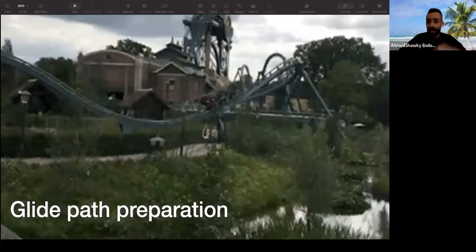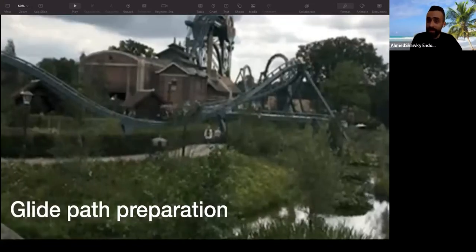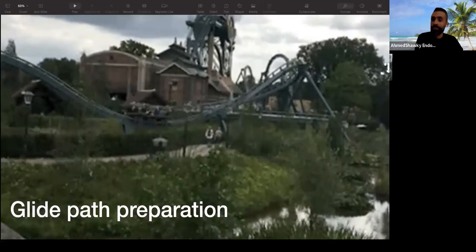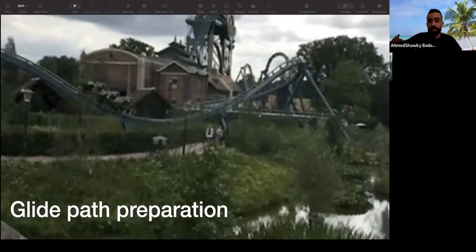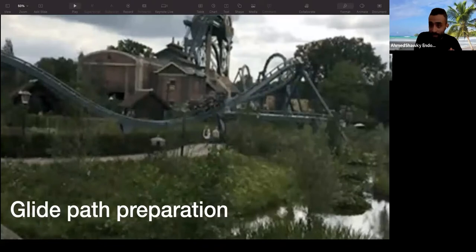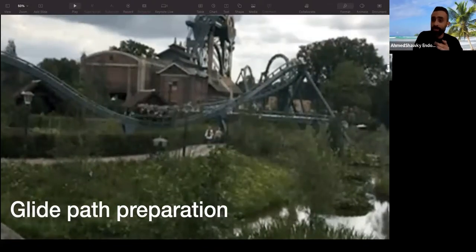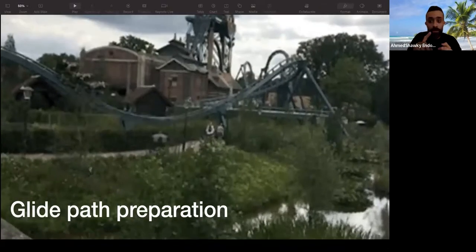They will fly anywhere. That's what happens when you take a mechanical file, a rotary file, and you put it in the root canal without creating a smooth path from the coronal part to the apical part. The rotary file will not easily follow the anatomy, especially when difficult. So it may perforate, it may create a ledge, it may break.